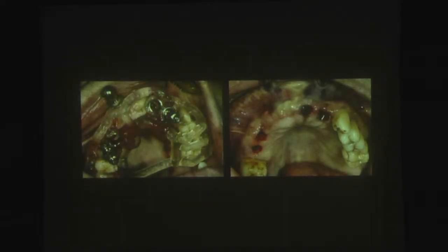On the operation day, we first fixed the guide. There was no need for fixation pins because we had so many teeth, but I wanted to do it in a certain way, so I put in my fixation pin. First of all, I made the guide stable with the fixation pin and with the socket fixation instrument.